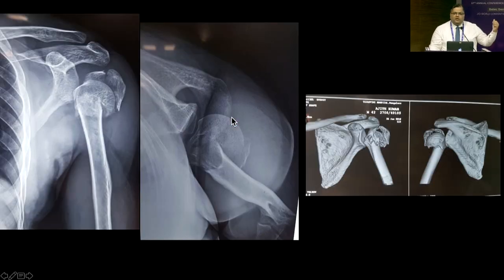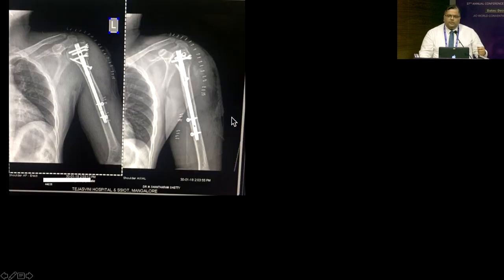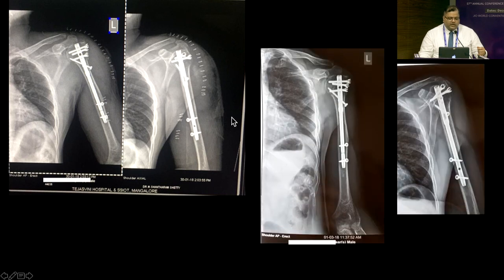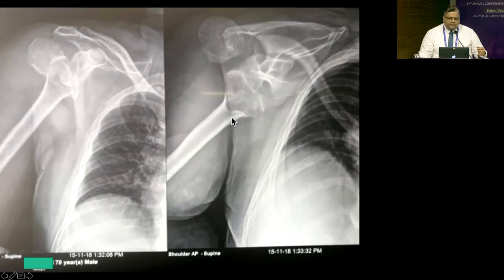Number one, I have kept 2-part out, and we'll look at 3 and 4 parts, all the complex situations that we can think of. Here is a 4-part fracture. As long as we could get a good reduction, good valgus reduction, and get the tuberosities back, which is the key factor, we could nail it. Union is not much of a concern. The patient should be doing good.